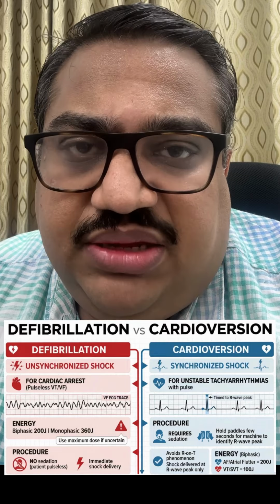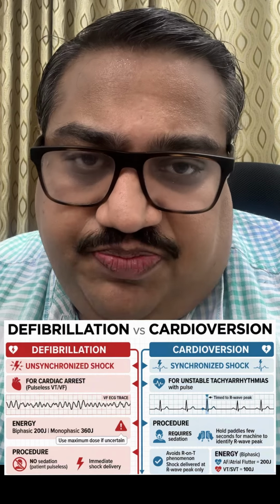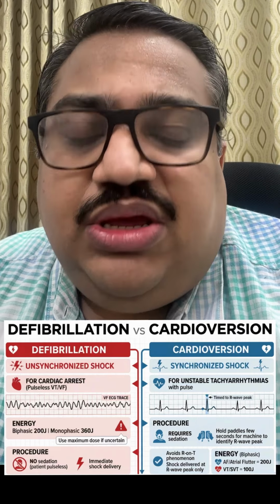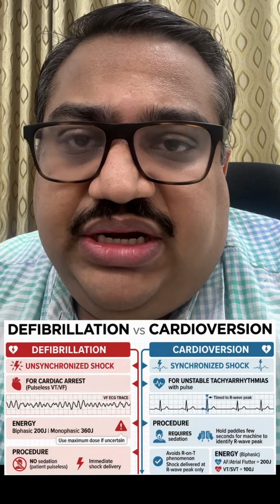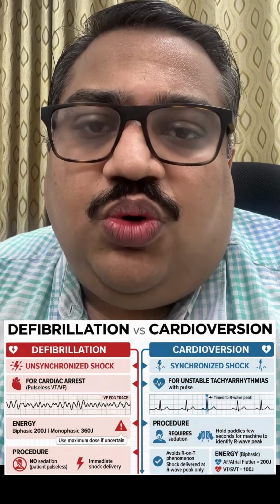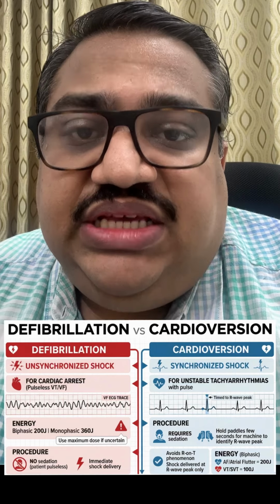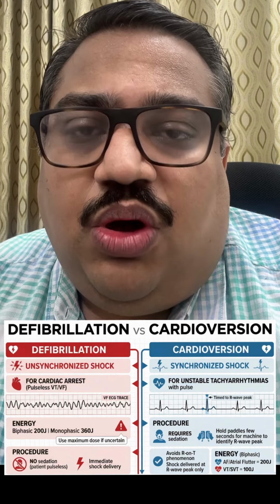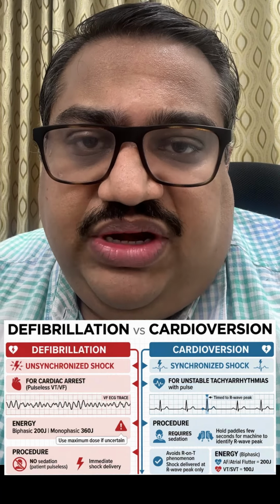Cardioversion is nothing much. Whenever you have an unstable cardiac tachyarrhythmia, or a stable cardiac arrhythmia which is refractory to the routine treatment measures with pharmacotherapeutic agents, you will decide to go ahead and do a procedure called cardioversion. Cardioversion is always synchronized. We synchronize it at the peak of the R wave to avoid the R-on-T phenomenon, to avoid a life-threatening arrhythmia like VF or VT developing from that.